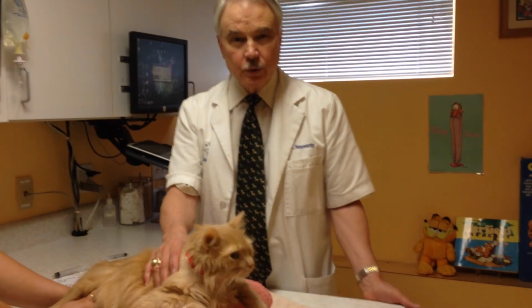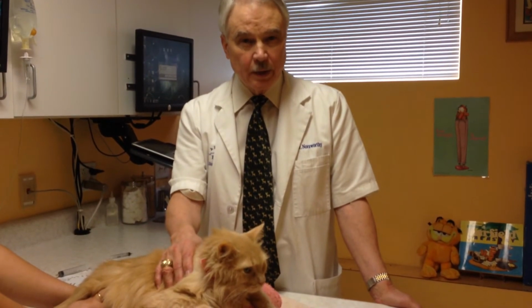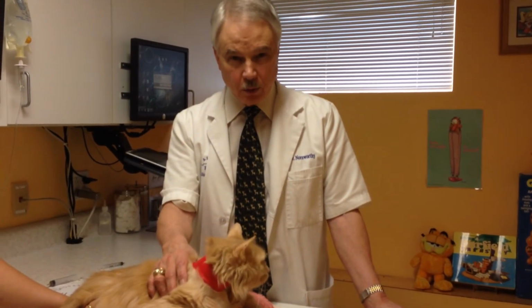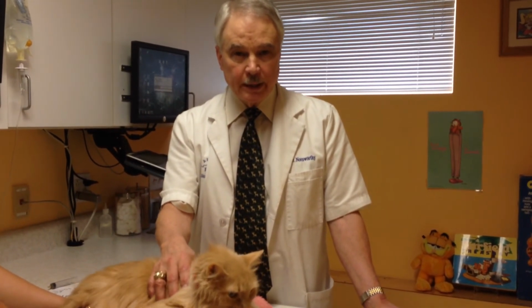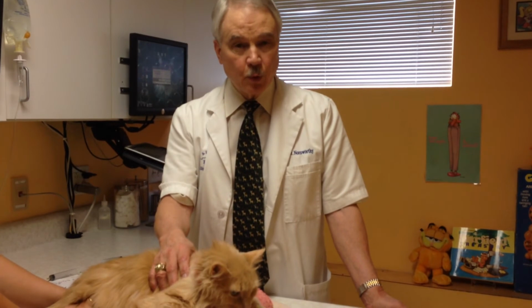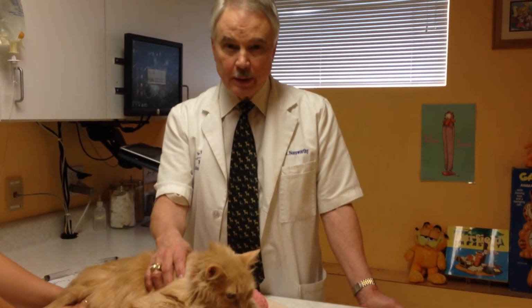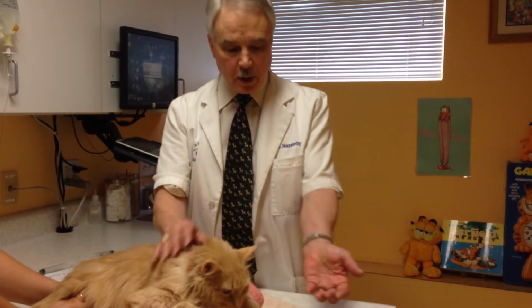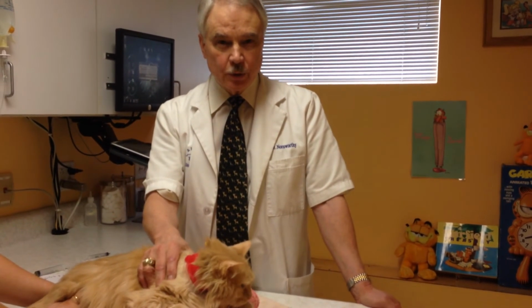You put the unused food back in the refrigerator. It's good for about 5 days. You will heat it before the next feeding. Heating is important because if the food is cold, it will, first of all, be very difficult to push out of the syringe, and second of all, the cat is more likely to vomit if the food is too cold. You can also get the food too hot. So what you want to do is put a small amount of it on your forearm, just like you were testing food for a baby, to be sure the temperature is comfortable.